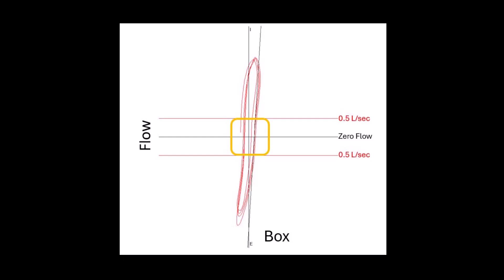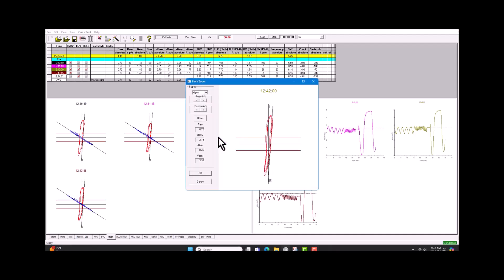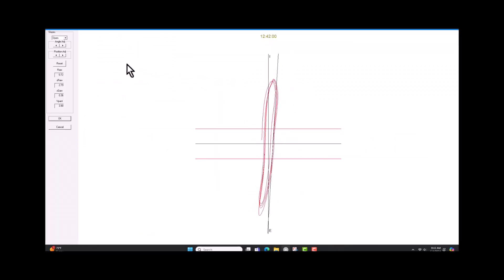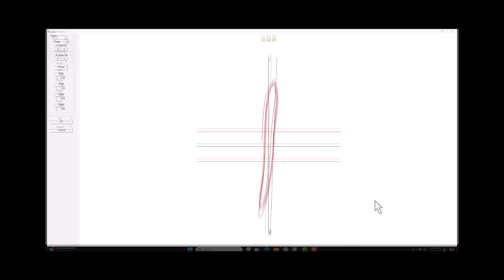Because of the limited data between the flow lines, adjusting the open shutter panting will become more frequent than the closed shutter breathing. To adjust the line of best fit for an airway resistance effort, double-click on the graph. The red or open shutter panting graphic will be displayed. Again, use the angle adjust arrows in the upper left to adjust the angle of the line of best fit if needed. Remember to only use the data between the red flow lines when adjusting. Experts will tell you that one of the most important points to remember is consistency when adjusting the line of best fit.